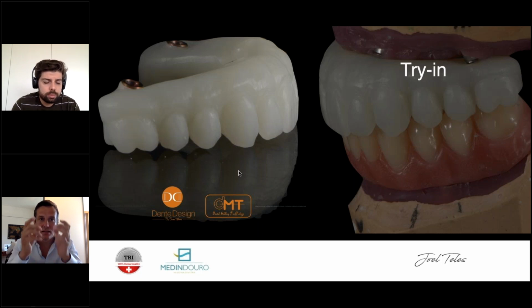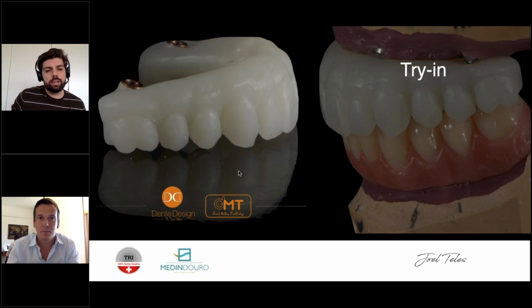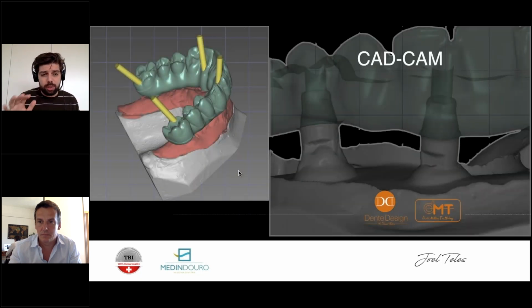And anyway, you get your prosthetic placed in one piece and screw retained on the abutments. That was a very good question, because we sometimes place implants at 45 degrees and can only compensate that to 30 degrees. That was a very good question, but you perfectly answered that. So this try-in is where you do everything you need to do regarding your lateral movements, protrusive movements. Remember, if you are dealing with monolithics, after this you don't get to touch anything. So make sure everything is perfect occlusion-wise in that appointment.